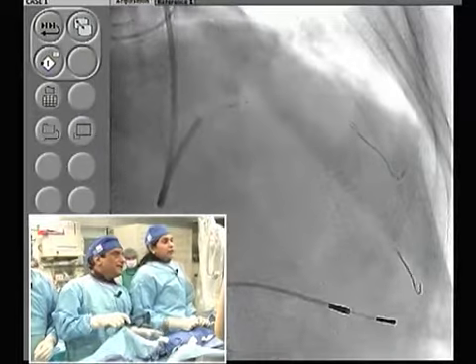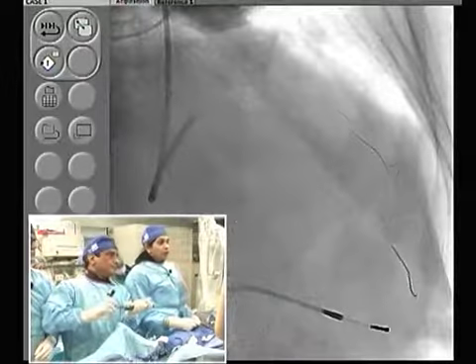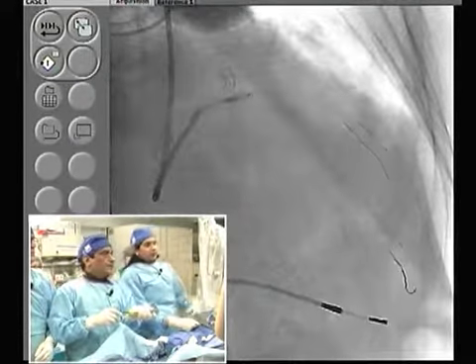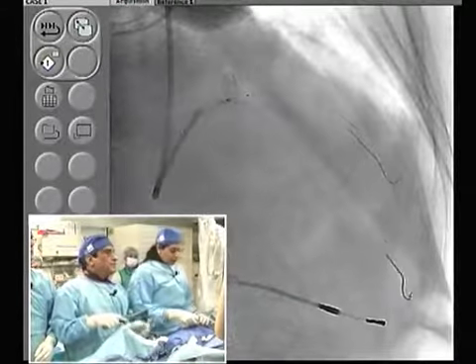Let's come to the ostium. A 2.5 cutting balloon? Yes, and same thing with the cutting balloon. Since we are doing the native ostial lesion, you go anywhere between 6-8 atmospheres, and at the same time you make sure the ostium has nicely expanded.